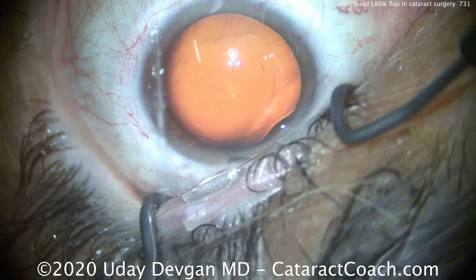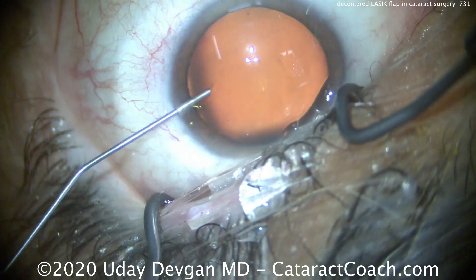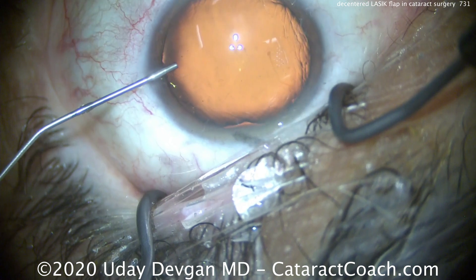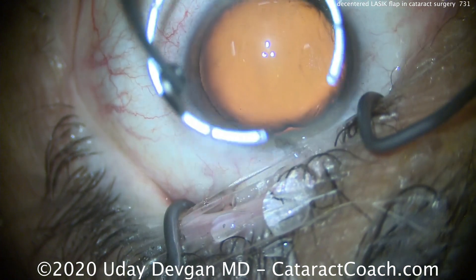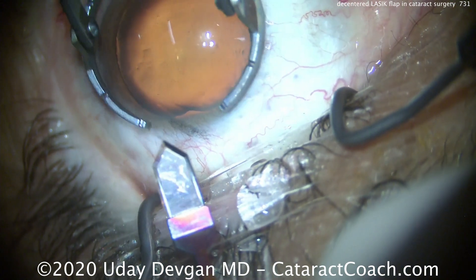So much so that we determined a toric lens would probably not serve him very well. So we're going to do instead an incisional approach to treating the astigmatism. Putting viscoelastic in to fill up the eye. Here's how we're going to do it differently: we're going to use our diamond keratome and make an incision on the steep axis, or steep meridian.